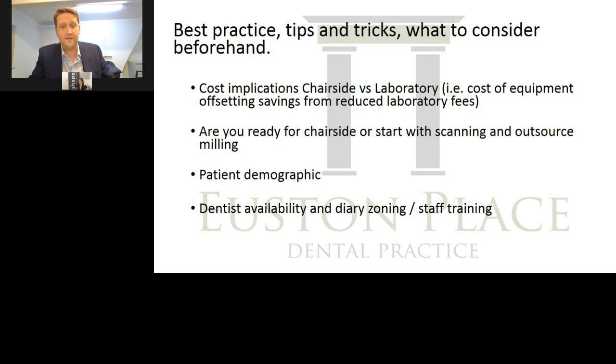If you're going to have availability, or if you're zoned or you have treatment sessions, keep those free for same day restoration, so you can actually do that same day rather than having to just fit a temporary and get it back later. But again, your first cases, you'll probably want to do that anyway.